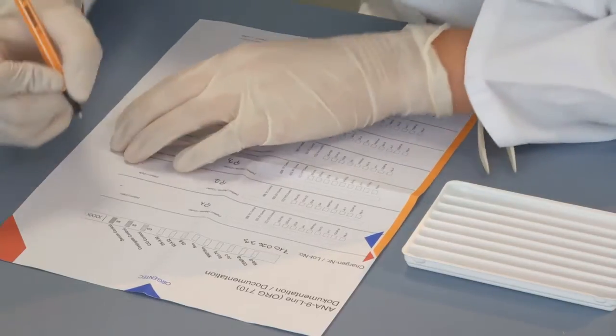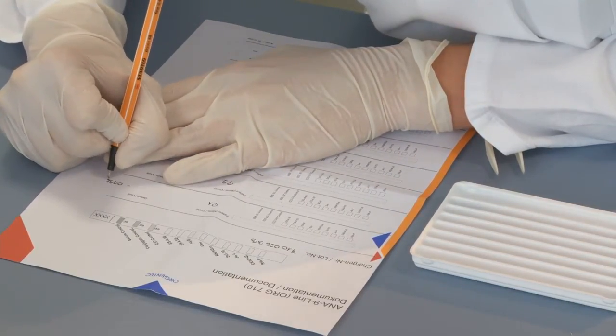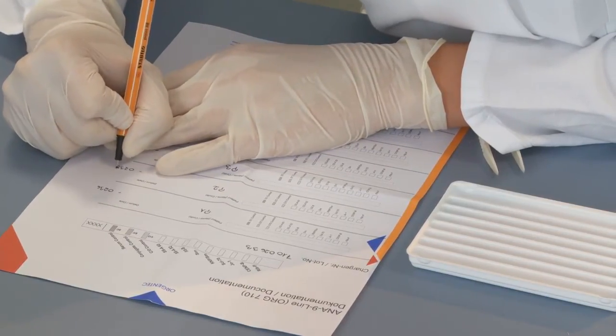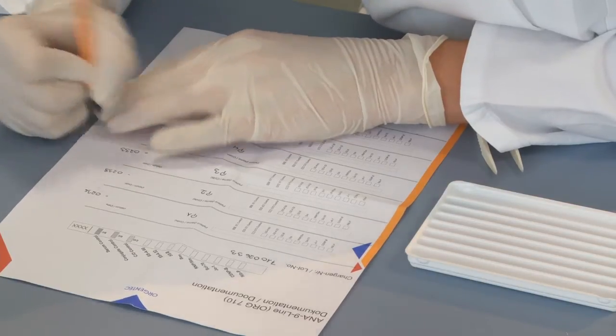On the documentation sheet included with the kit, the numbers of the blot strips to be used should be noted in the order in which they are placed into the incubation tray. The laboratory numbers of the patient samples are added to the sheet for the corresponding test strip.